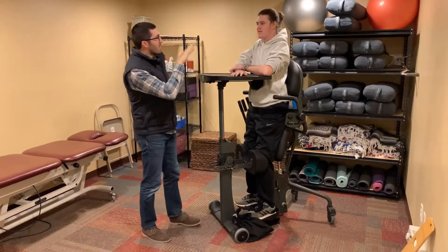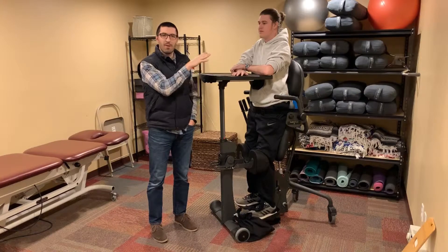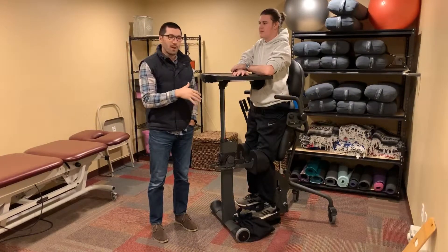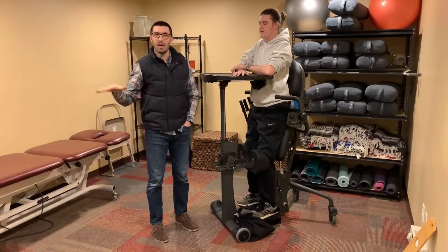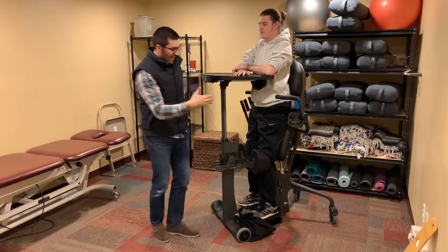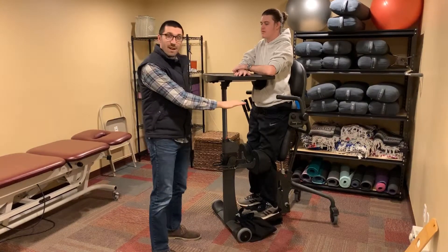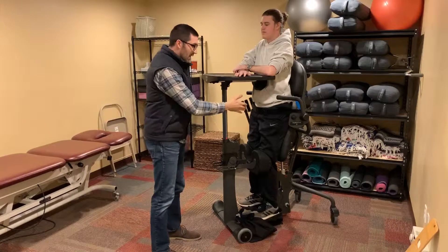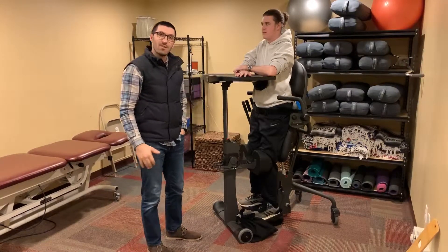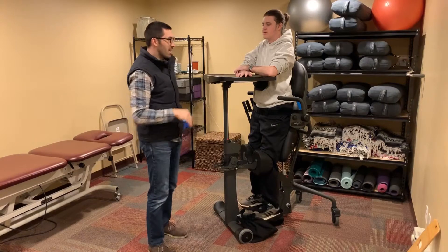Just some things that we're thinking about before we even got into the stand table: we did a slide board transfer in, we actually removed the table portion of this, and if you haven't seen one of these before, it starts out in a sitting position. So when we did that slide board transfer we just went from his power wheelchair into this.